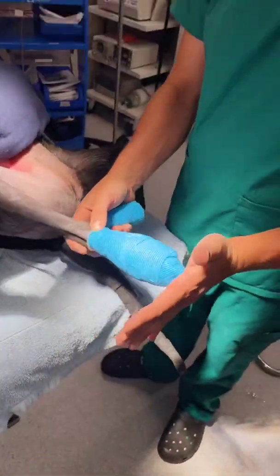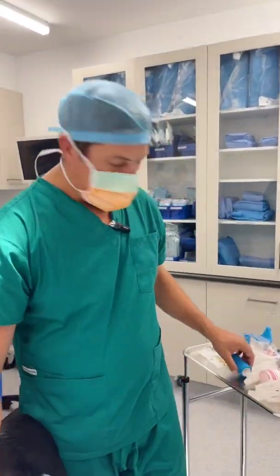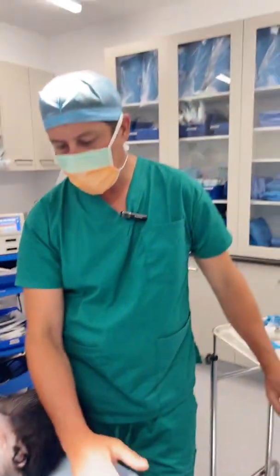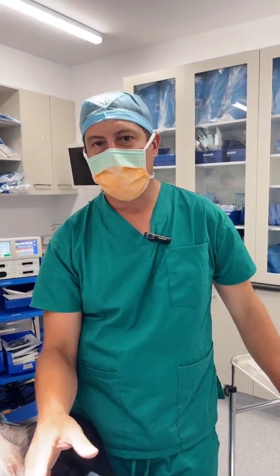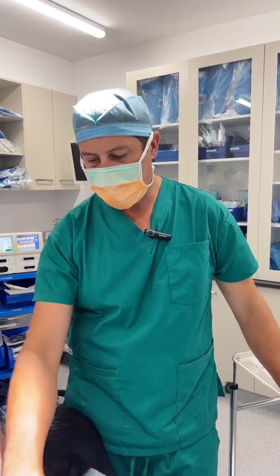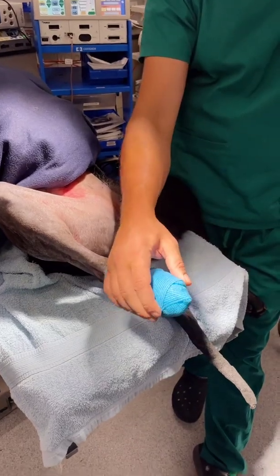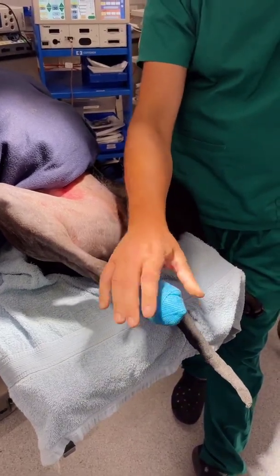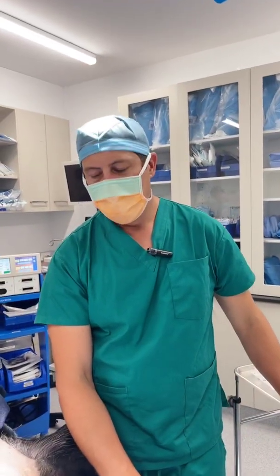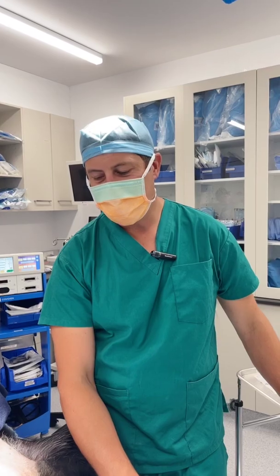That's a nice bandage — it'll stay on there for about a week. We'll change it in a week. Obviously getting the owners to watch out for any strikethrough or concerns. Most importantly, if the dog is using the leg well and suddenly stops using it, you wanna get that bandage off and have a look — make sure there's no swelling. We would normally leave the toes exposed so you can check for swelling, but in this case we've bandaged them up to get enough coverage and protection of the foot. Hope that was helpful — I'm gonna include those bloopers. Have a good day, cheers.